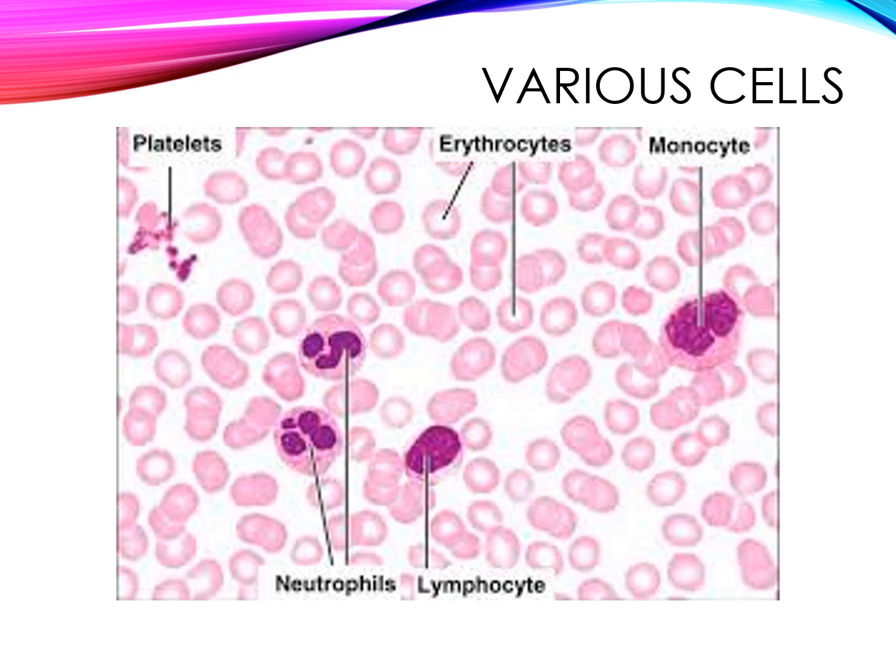So here is an example of a blood smear, and I want you guys to start being able to identify the different types of cells. So if you look, these are all red blood cells or erythrocytes. They're taking up the red stain, and they do not have a nucleus inside, and they usually have some amount of central pallor depending on the species.